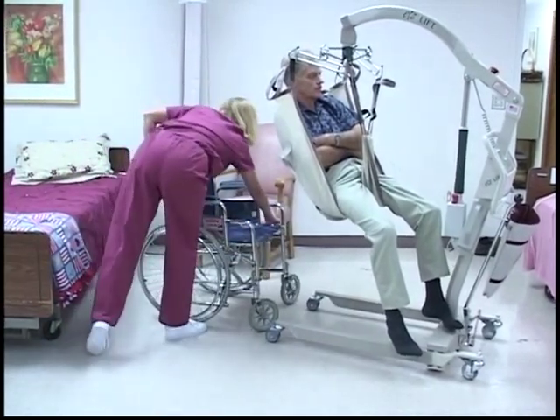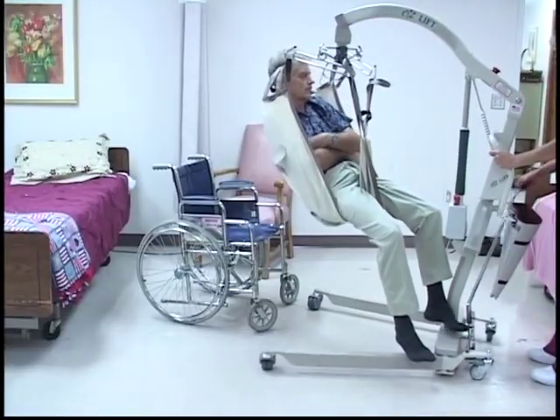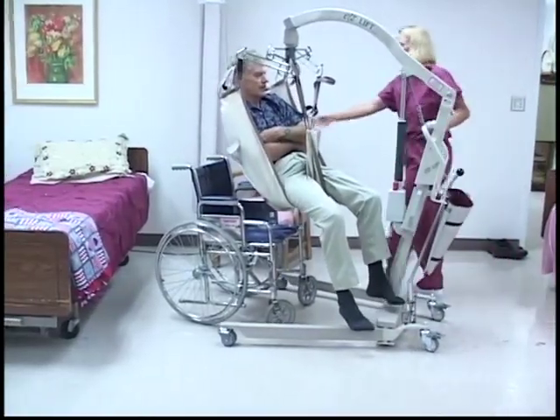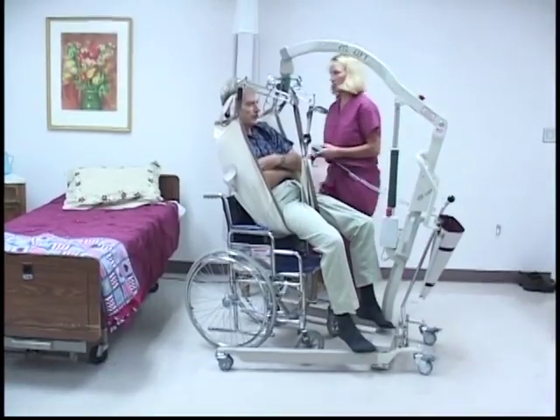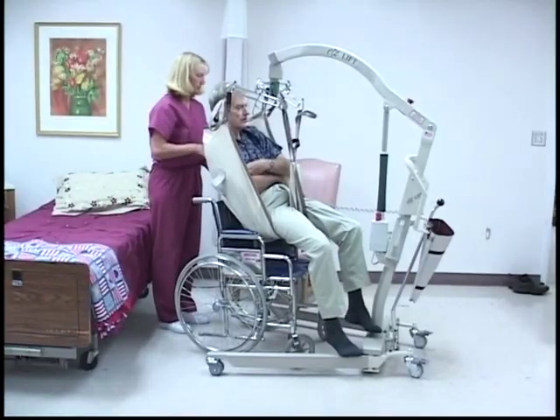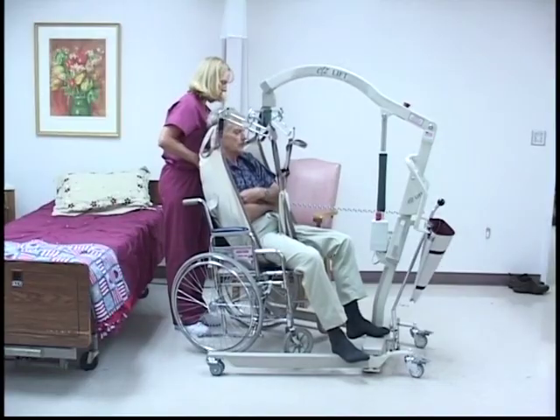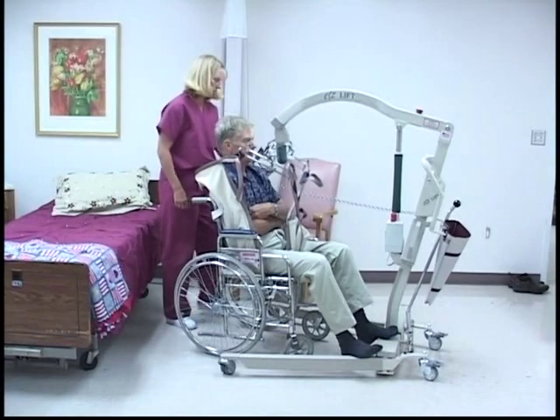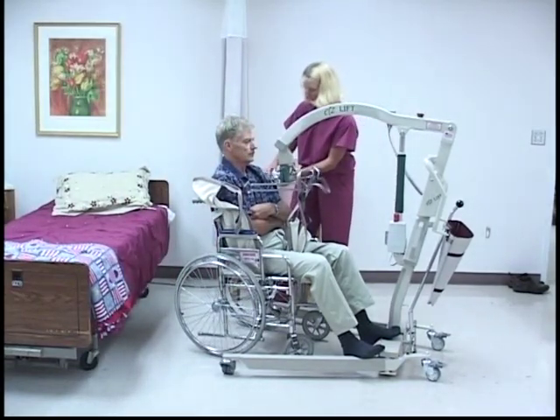With the spreader bar and legs opened, position the wheelchair under the patient. Stand behind the wheelchair and hold both of the side handles on the back of the sling or the middle handle. Hold your hand level and lock your hand against your stomach as the patient is being lowered. When the patient is 1 inch from the seat, grab the handle and position the patient comfortably in the wheelchair. This will ensure that the patient will be seated in an upright position when fully seated in the wheelchair.